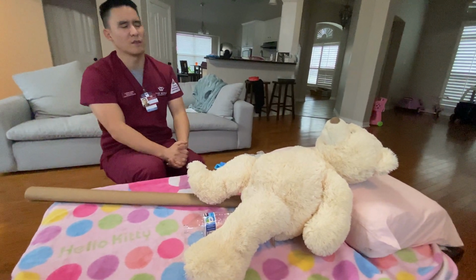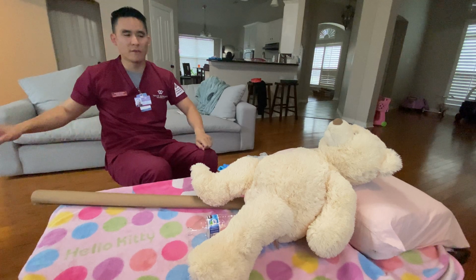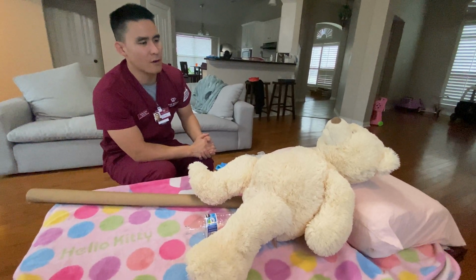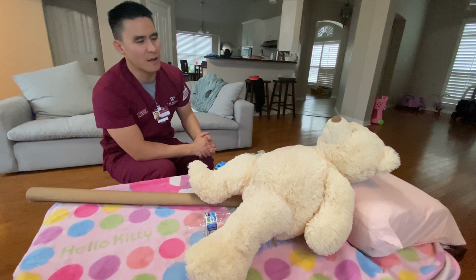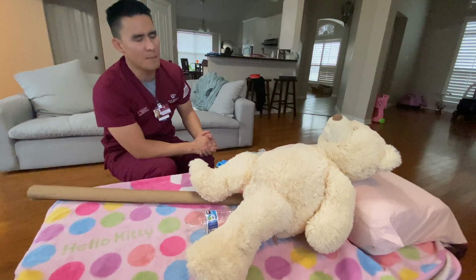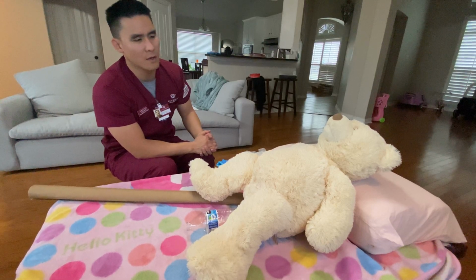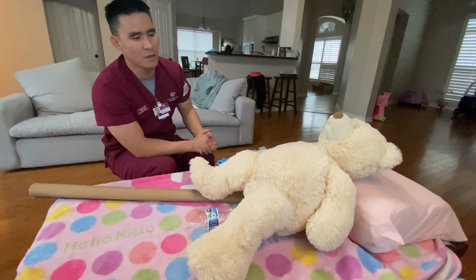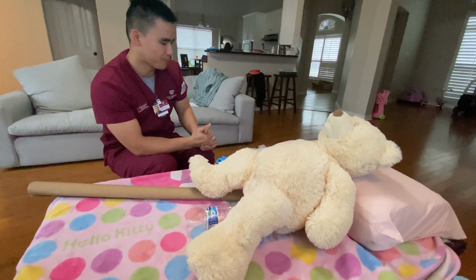Okay. So we have the door closed and the curtain pulled for your privacy and comfort. And the reason why we're doing a catheter replacement is to help prevent any fall risk. So right now you have a little bit of immobility, and this will help empty your bladder as well as reduce the number of trips you have to take to and from the restroom, which will help prevent fall risk.